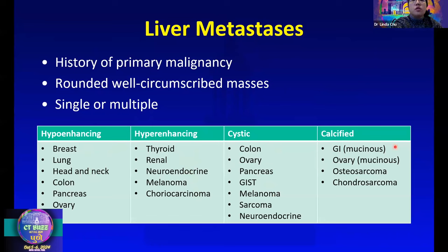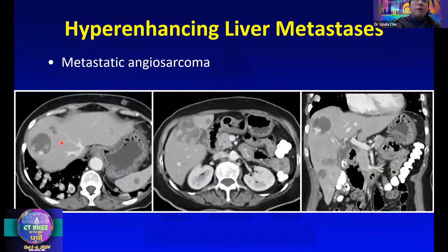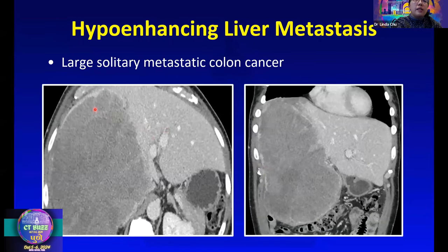Calcified metastases tend to come from mucinous GI or ovarian primaries, or from bone tumors. Here's a case of metastatic cholangiocarcinoma with the classic targetoid appearance — a brighter peripheral enhancing rim and central hypoenhancement. This target appearance is characteristic of metastatic disease, and you can appreciate the sheer tumor burden on cinematic rendered images. Here's a case of metastatic angiosarcoma — superficially it might look like hemangiomas, but the lung metastases in the lung bases give away the diagnosis. Sometimes liver metastases can grow to be very large, like this large solitary colon cancer met that could initially fool you into thinking it's a primary liver lesion.